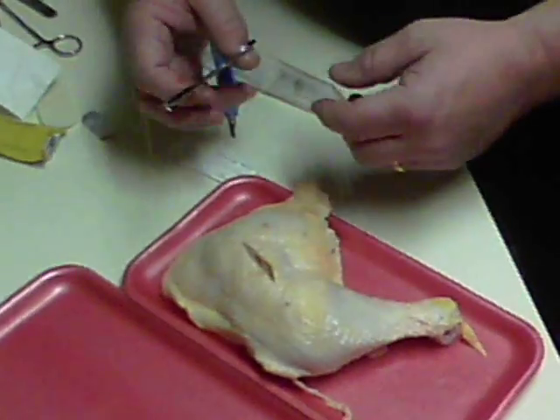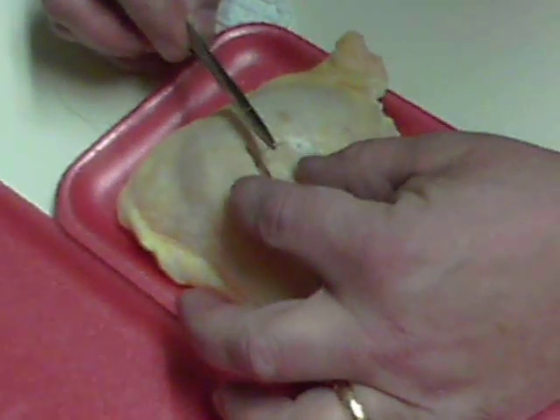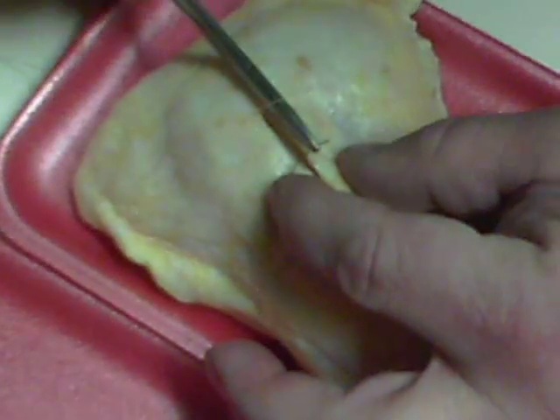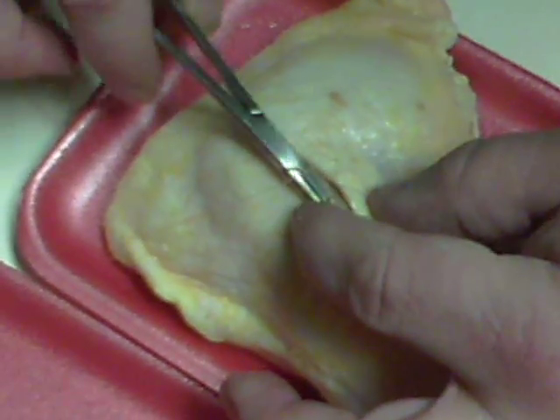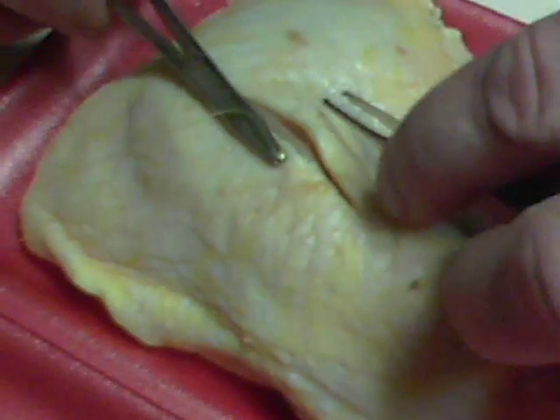So I'm going to make one. When you're doing something like this, you're going to want it to be in the middle of the wound, right? So it pulls it together. So you put it down, see about how far out you're going. And then where's my little tweezers? The best way is to come back with the tweezers.